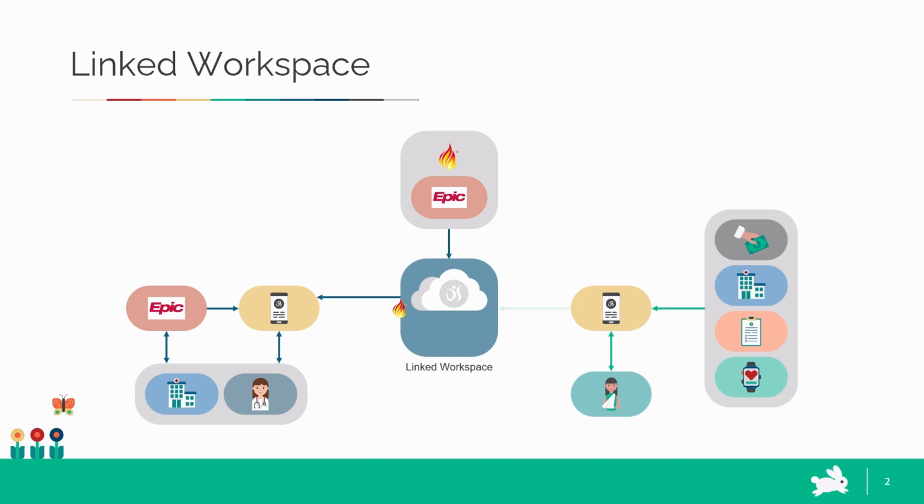For example, it can allow patients to upload the data from their devices or other sources. This data is stored in a separate database within the linked FHIR server. The FHIR resources in this database are linked to the data in the EHR FHIR server in a way that any external app can access the combined data just like a smart app accessing any regular FHIR server.